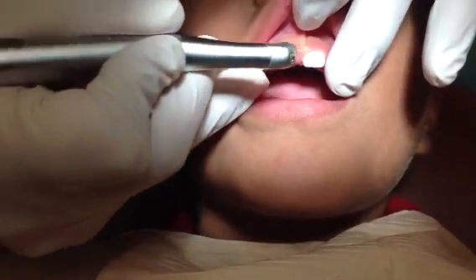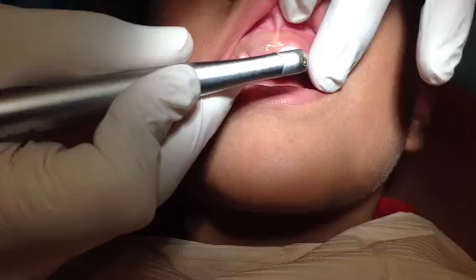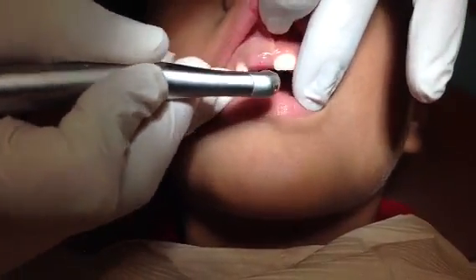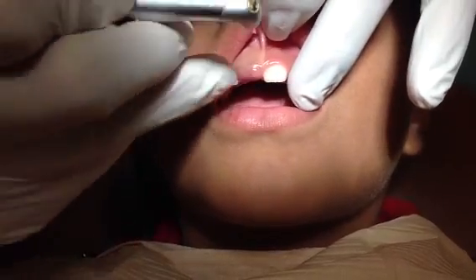Hi everybody, I'm Dr. Herman. Today we're going to expose this tooth. He's got a maxillary left central incisor in and a maxillary right incisor not in. We're going to use a Waterlase laser, and here we go.